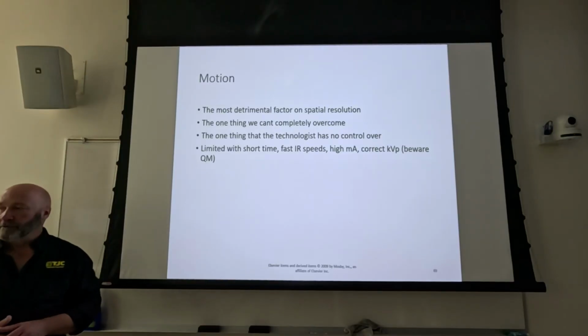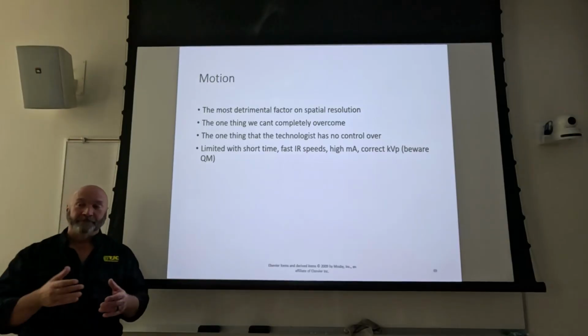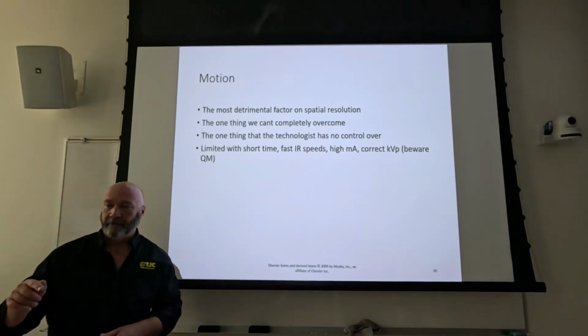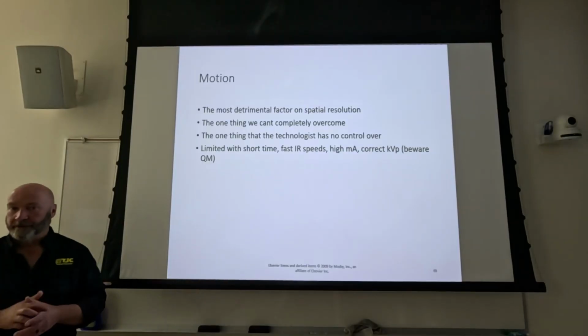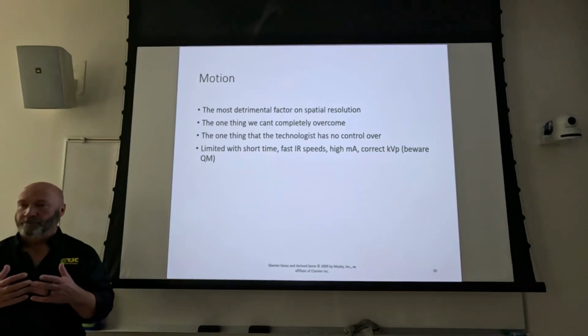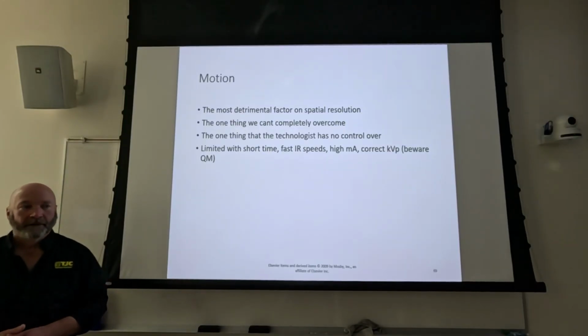What about if you're phototiming? You don't control either one of those, really. So how can you reduce exposure time if you're phototiming? Your technique. Specifically mAs? No. Well, mAs, if you up your kVp, because it'll penetrate. Bingo, right. It's not ideal, because you want to use a kVp that's pretty consistent within the range of the anatomy that you're shooting.